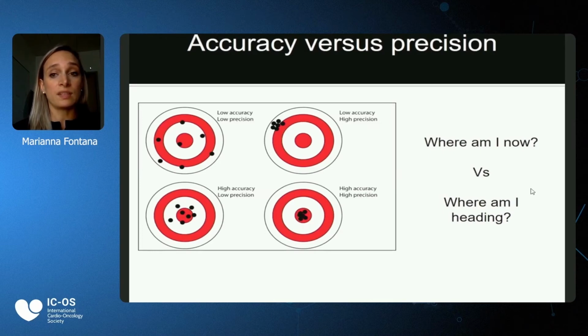So the question is then very different. It is not what the patient has, but how do the images now compare to before? And this is not anymore an accuracy question, but a precision question. And why is that important? Because imaging modalities or parameters that can have a high accuracy may have a very bad precision.